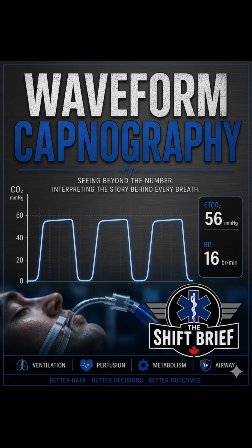On today's episode, we're going to talk about waveform capnography. We're going to look at how CO2 is made, how it moves through the body, and how it's eliminated. Not only is waveform capnography the gold standard for intubation confirmation, but it's widely applicable in multiple other settings. So let's get going and dig into it a little bit.